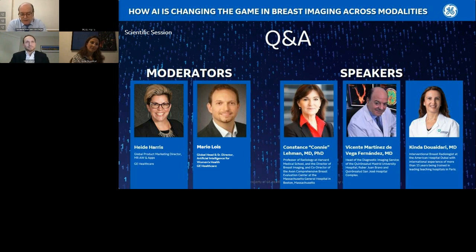Yes, for me, contrast mammography could be great if you don't have access to MRI, because if you have access to MRI, you have more information: more anatomical information, more functional information through the dynamic exam during 6 minutes, and more functional information through the diffusion sequences. So if you don't have access to MRI, contrast mammography is perfect.